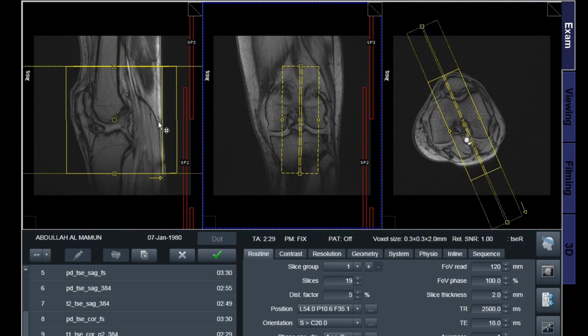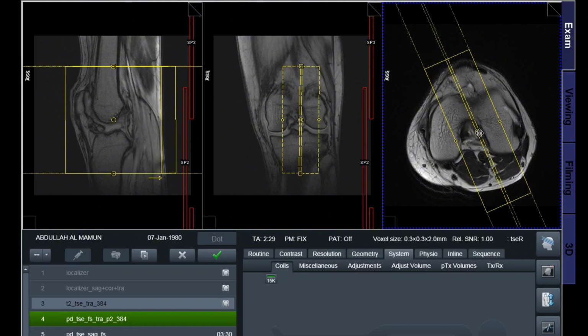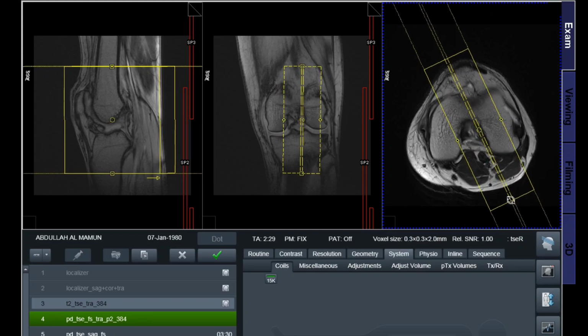What does an MRI left knee report show? An MRI report usually mentions the condition of ligaments, intact or torn, meniscus, normal or damaged, presence of joint effusion, cartilage thickness and defects, bone marrow changes, and degenerative or arthritic changes. Based on this report, doctors decide further treatment or surgery.